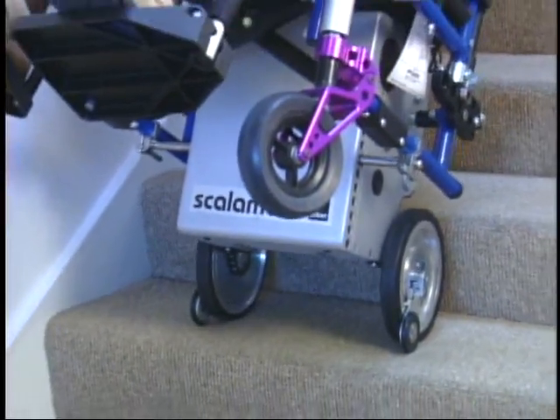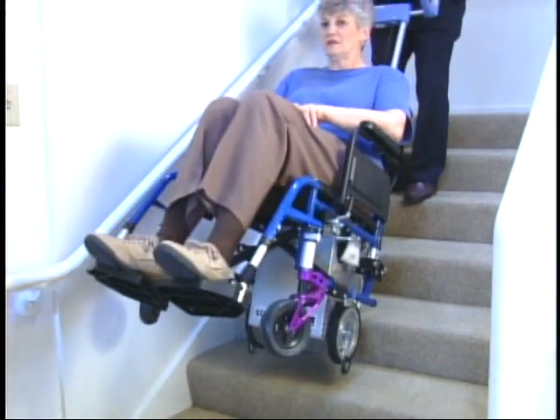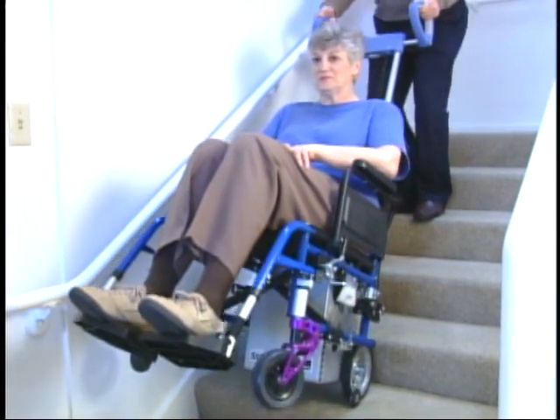Pressing the down button puts the wheelchair in motion. Slightly pushing forward moves the Scalamobil to the next step until you reach a landing or the bottom of the stairs.